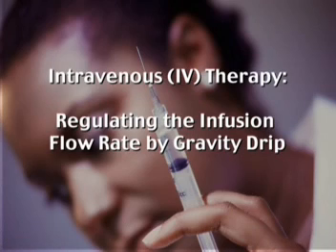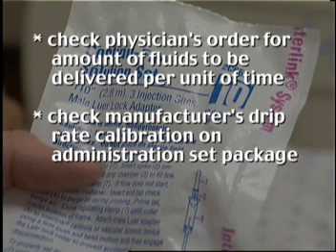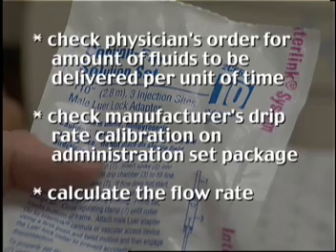Regulating the infusion flow rate by gravity drip. Check physician's order for amount of fluids to be delivered per unit of time. Check manufacturer's drip rate calibration on administration set package. Calculate the flow rate.